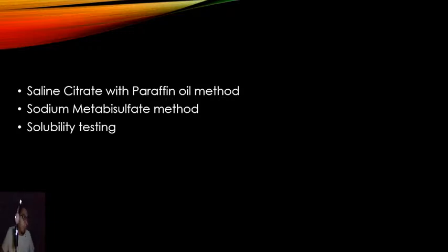They are all chemical methodologies, and their main purpose is to induce low concentration of oxygen, promoting the polymerization of the hemoglobin molecules, and thus causing the cells to become drepanocytes. All right.